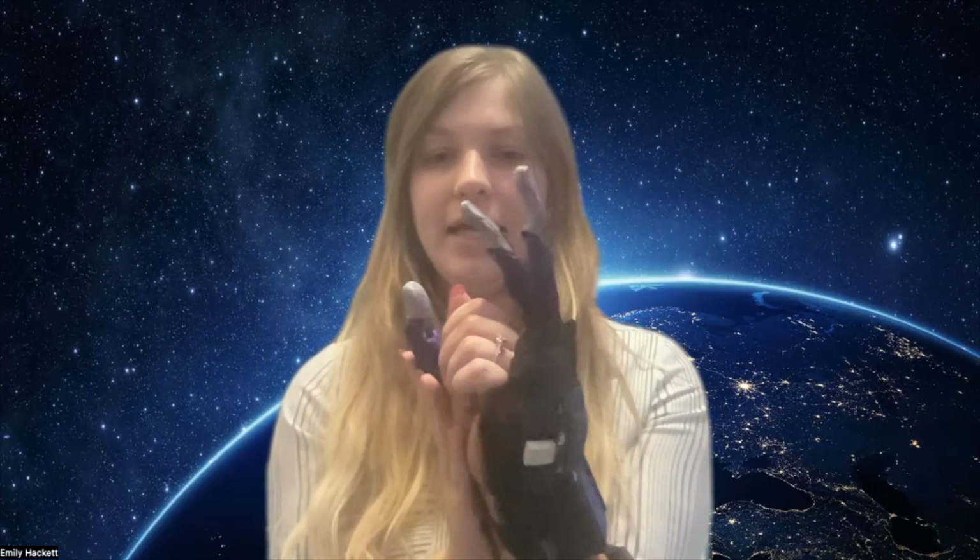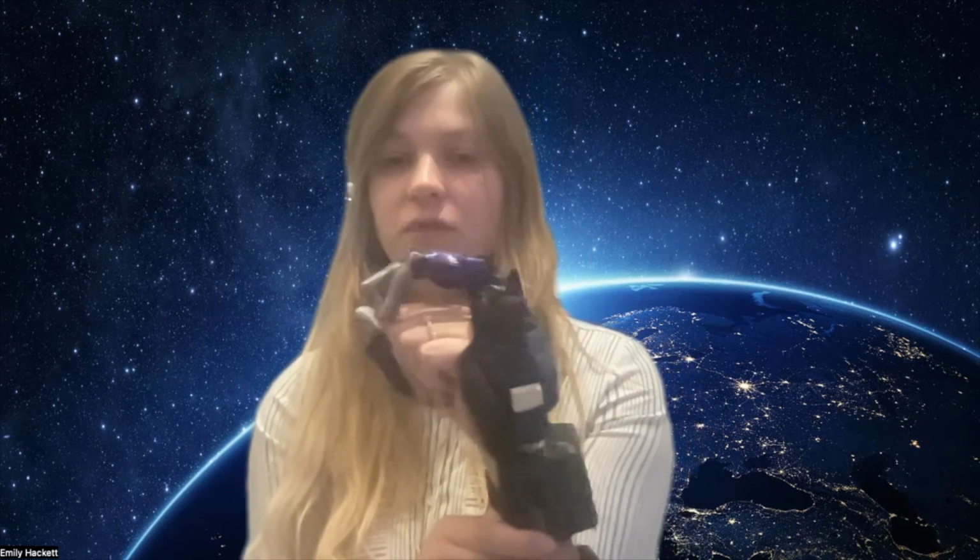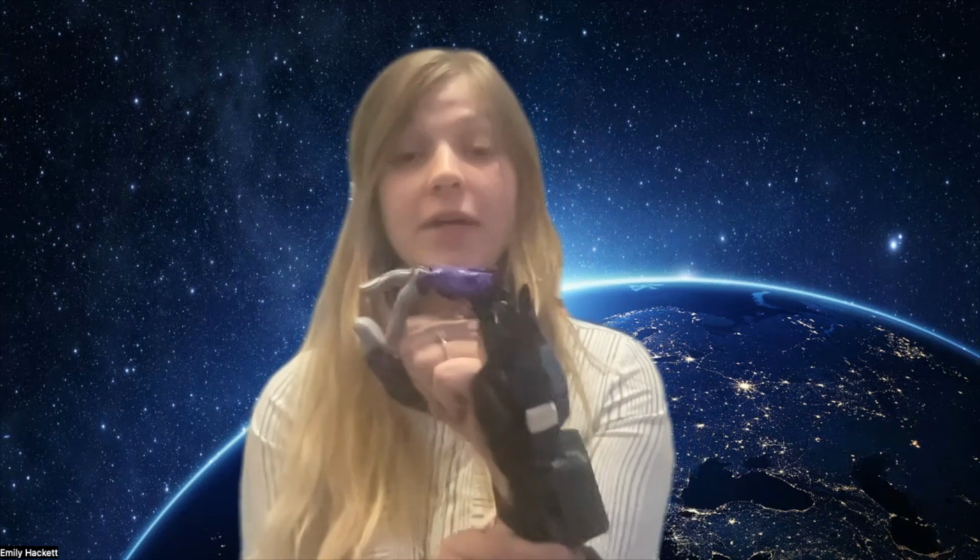This is the prosthetic hand design. There's fishing line tied in here that feeds into tensioning pieces. So when you flex your wrist forward, it pulls on the fingers, closing them into a grip. When you relax the fingers, they prop back up automatically due to elastic cords here causing tension to pull them back up. The splinting system here works very similarly.